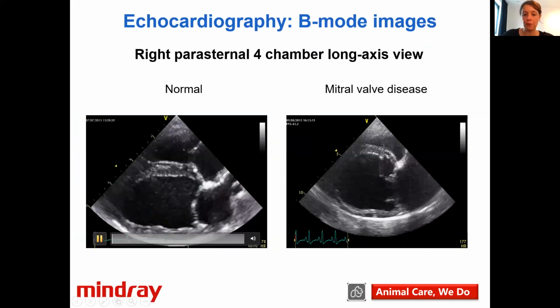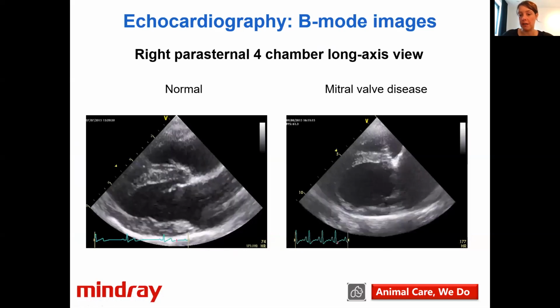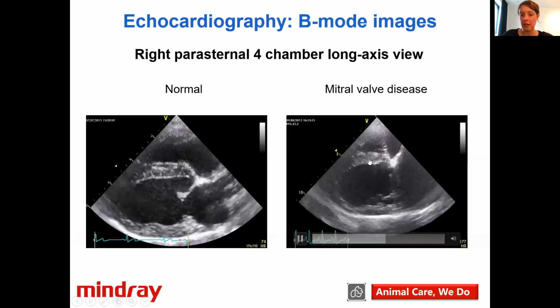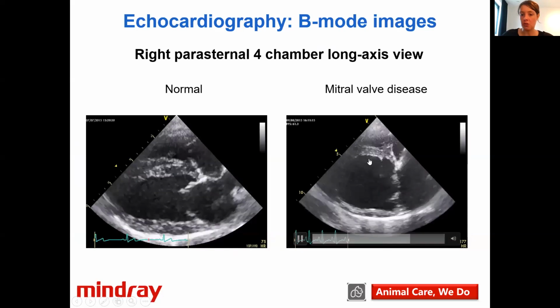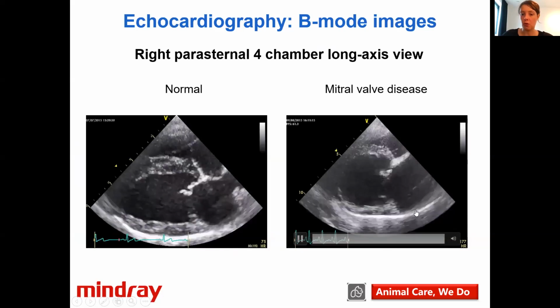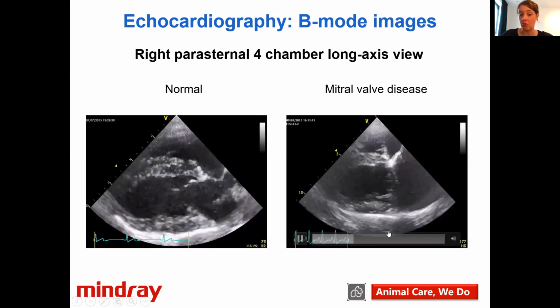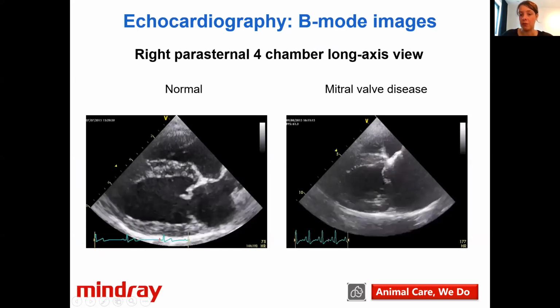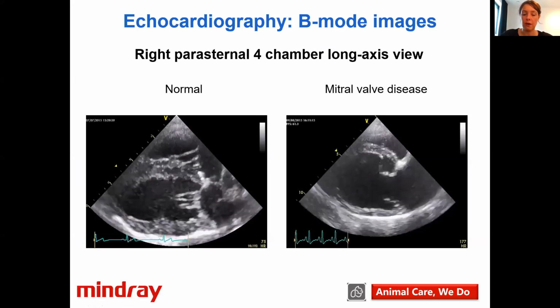I've included some examples to give you a first impression about what's normal and abnormal. Here again, you see a similar image as before. This is a normal canine heart. And here we see a heart of a dog with severe mitral valve disease. We see that the left side is very big. There is a volume overload of the left ventricle, and a huge left atrium, so there is an enormous increase. But despite the fact that it is so volume overloaded, the heart muscle is still moving quite well. It's trying to pump quite well. This is also the difference, for example, between a dog with mitral valve disease and a dog with dilated cardiomyopathy. The systolic function at first sight seems still quite okay. This is just an illustration of an abnormal heart.